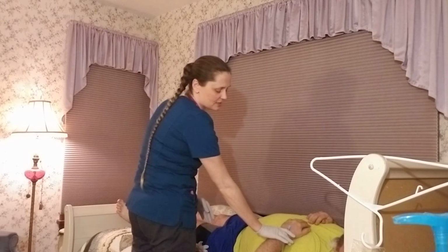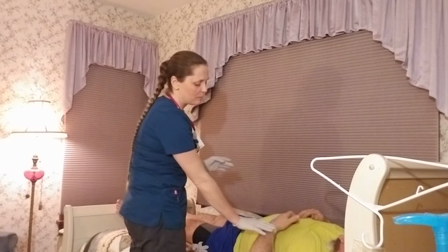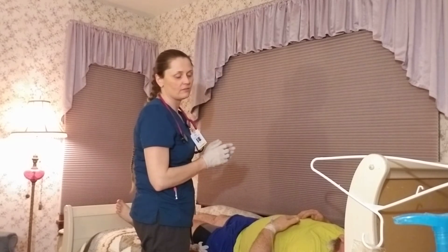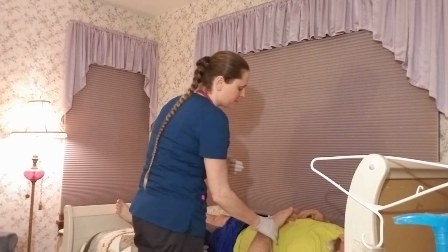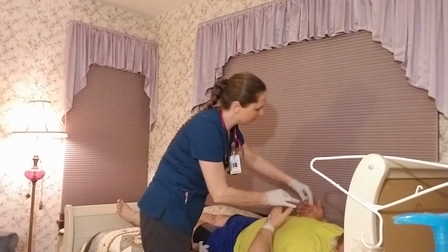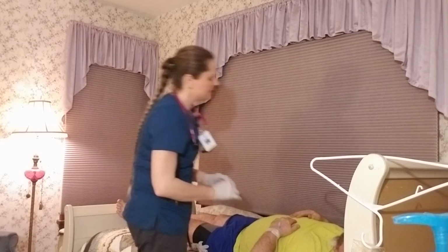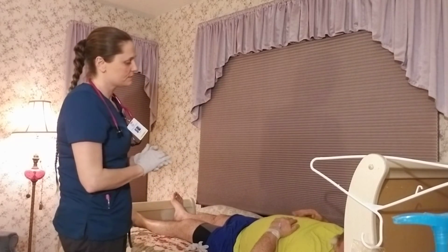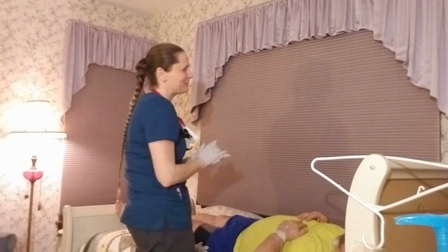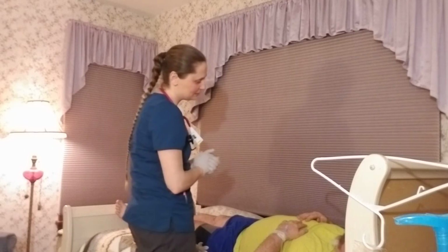I'll assess the patient's IV site, making sure there's no infection, infiltration, or extravasation. I'll make sure that the bandage is clean, dry, and intact, and verify that the fluids are flowing at the rate ordered. And then can you squeeze my fingers for me? Good. I'll check for cap refill bilaterally and the radial pulses bilaterally. Have you been experiencing any numbness or tingling in your hands? No. Okay. Have you experienced any shortness of breath? No. Any chest pain? No.